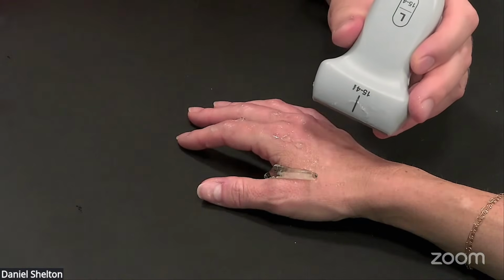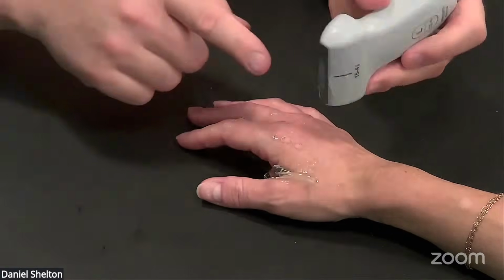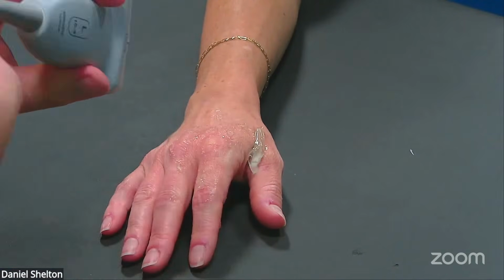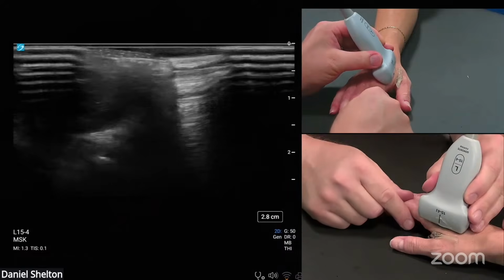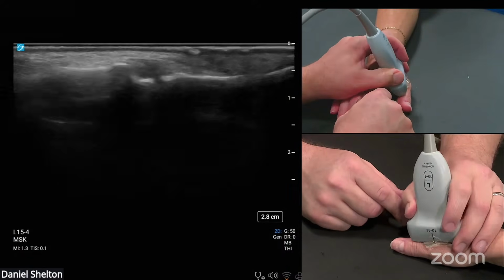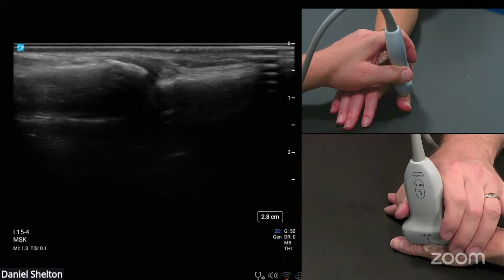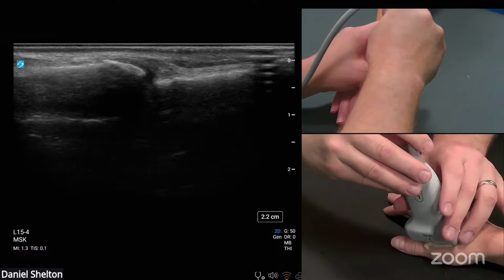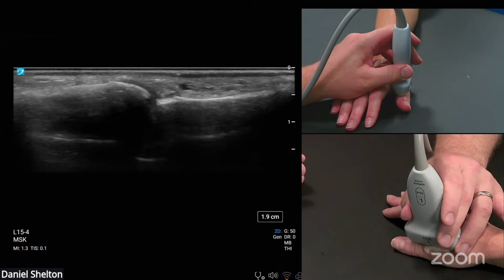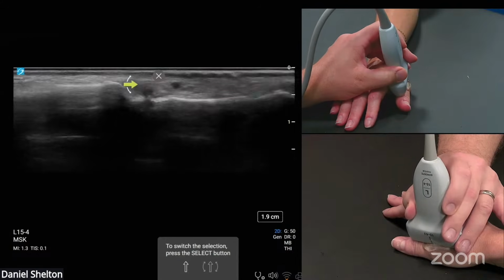So to see that joint in a true coronal, you don't want to scan at this angle. You really need to take the probe and lay it against the second MCP joint. So I'm going to lay this whole transducer against the second MCP joint and drop it straight onto the knuckle. And that is the extreme coronal plane I want you to take when you try this. And then you end up seeing that nice ligament come up more shallow here. Same, looking for the epicondyle looking surface, kind of like we did on the elbow, right up here, and seeing it bridge that gap.